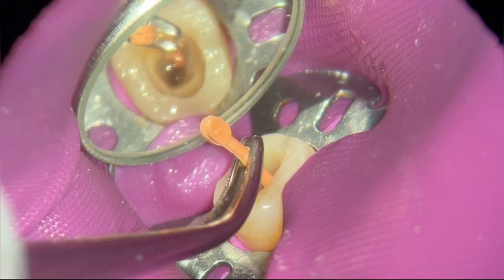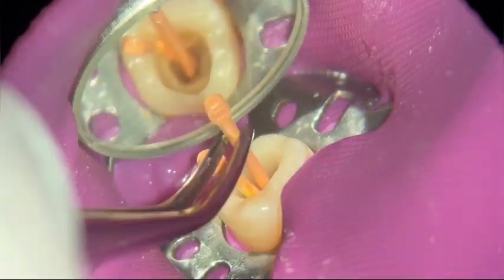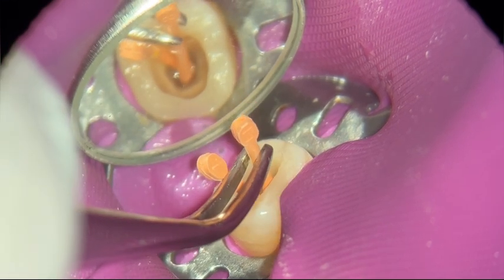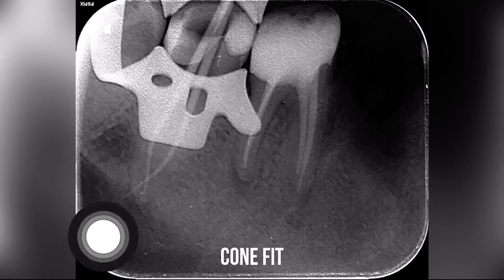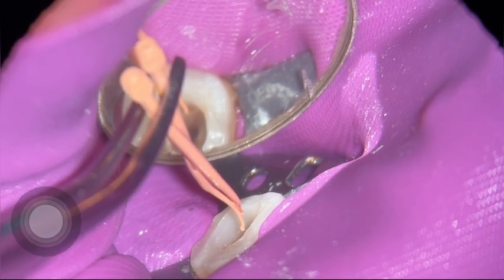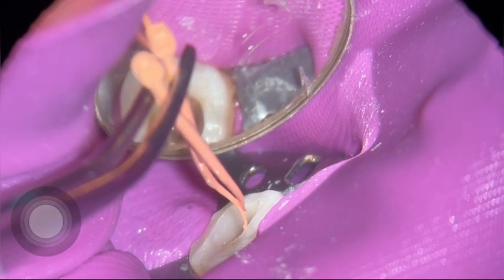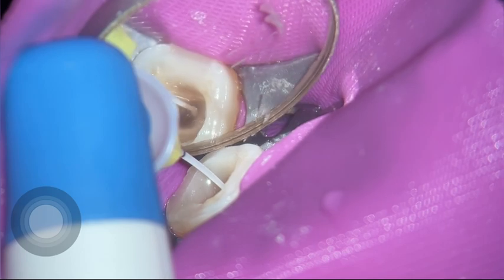I'm going for my cone fit, just to double-check and make sure my working length is correct and I don't need to make any more adjustments. I take the x-ray, and in this case I had to take one millimeter off of that mesial GP. But everything else looks good — very interesting anatomy. Look at that: the canals are just going around themselves. It's always nice to see, pleasing to the eye, and also on the final x-ray.